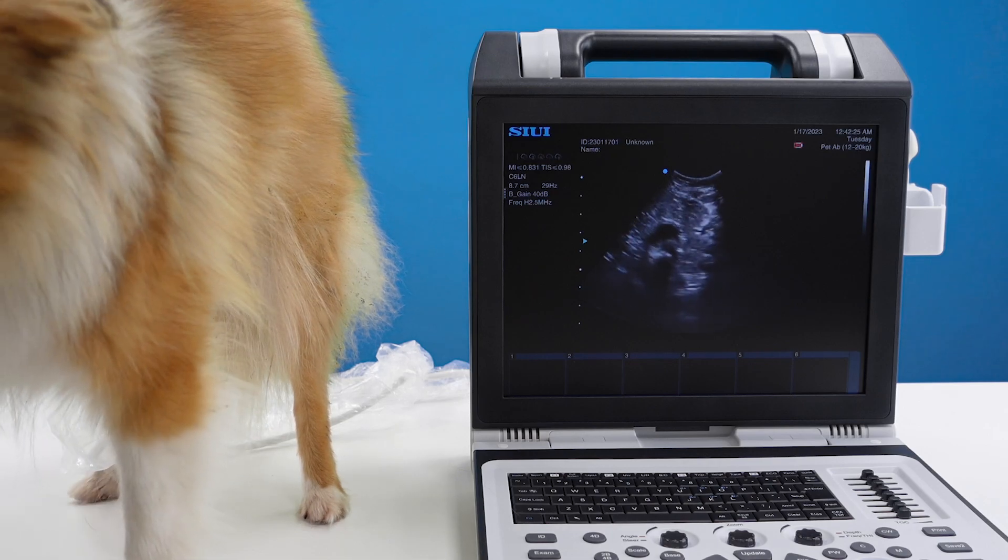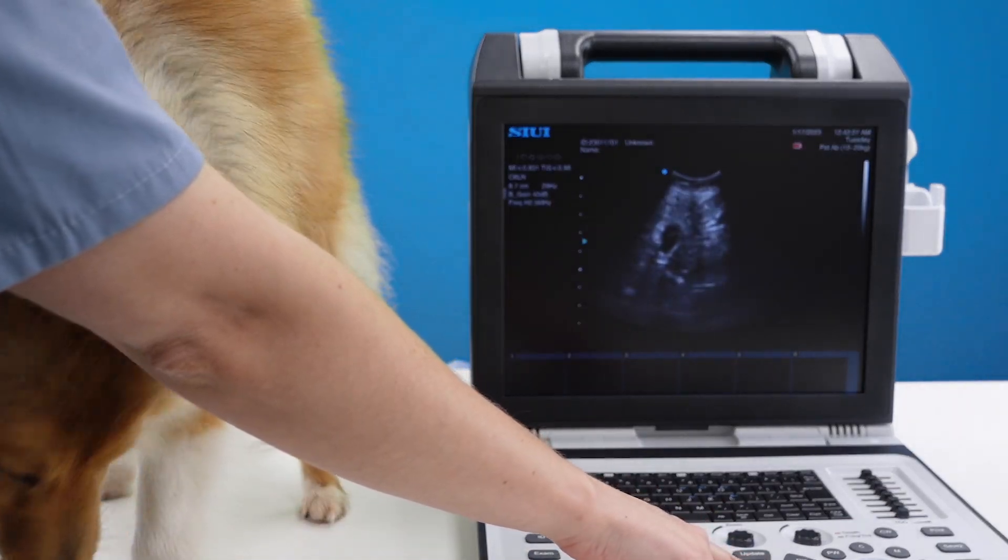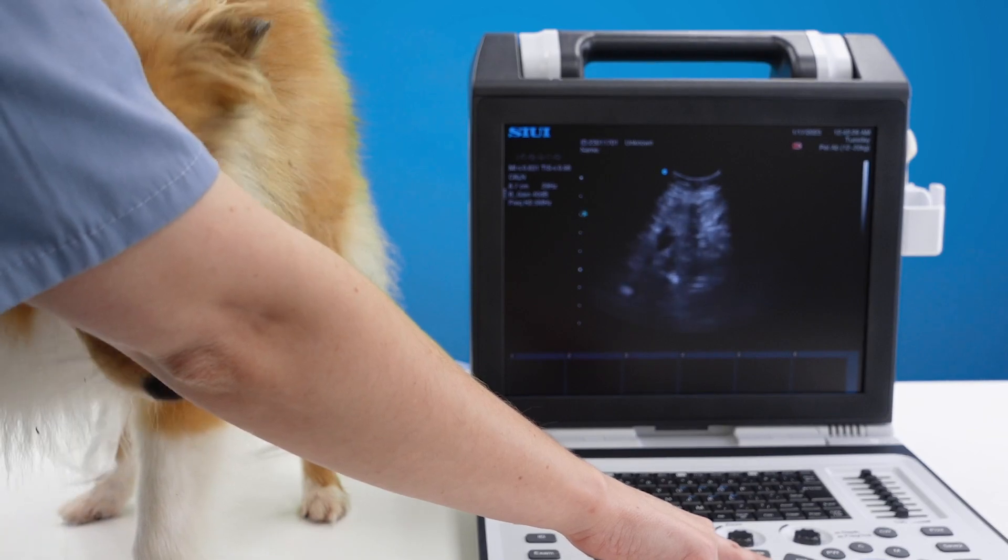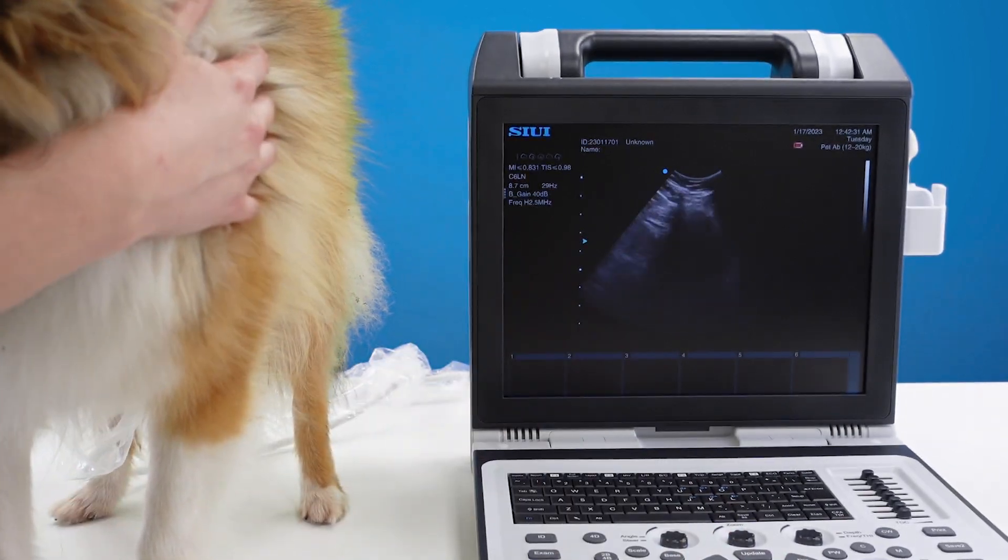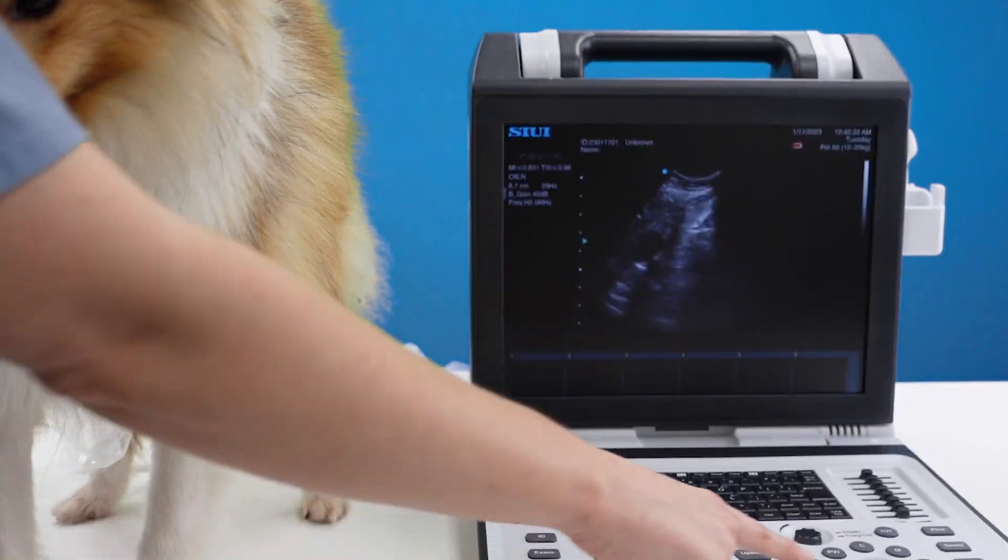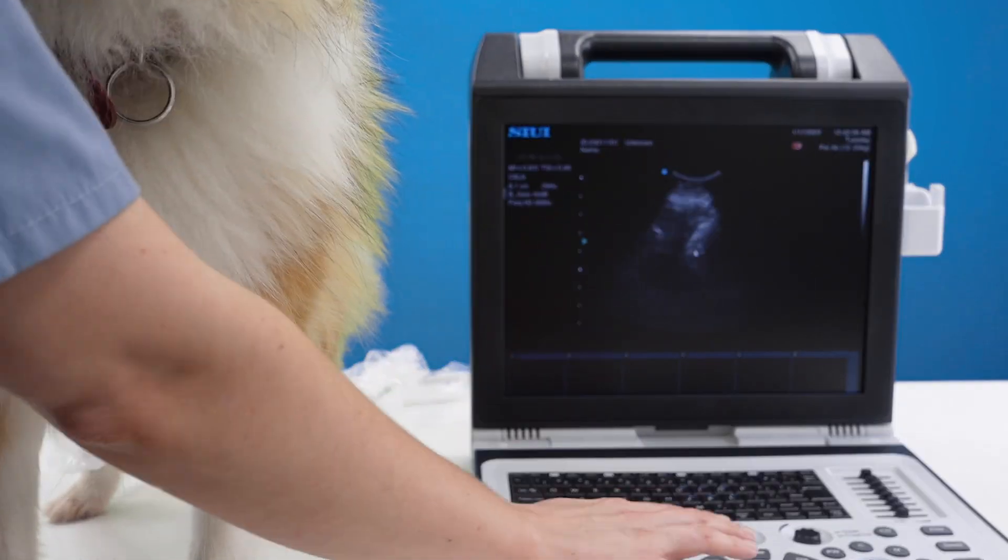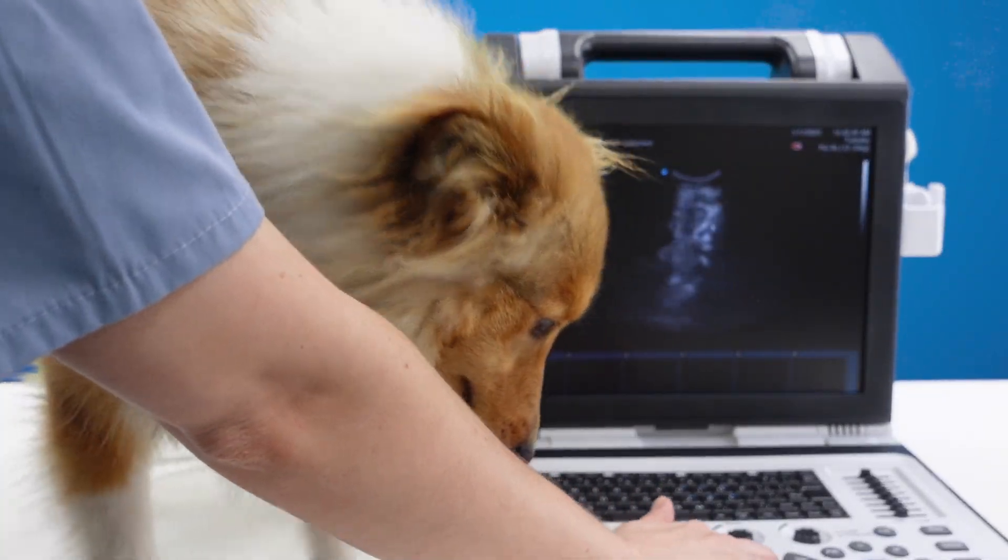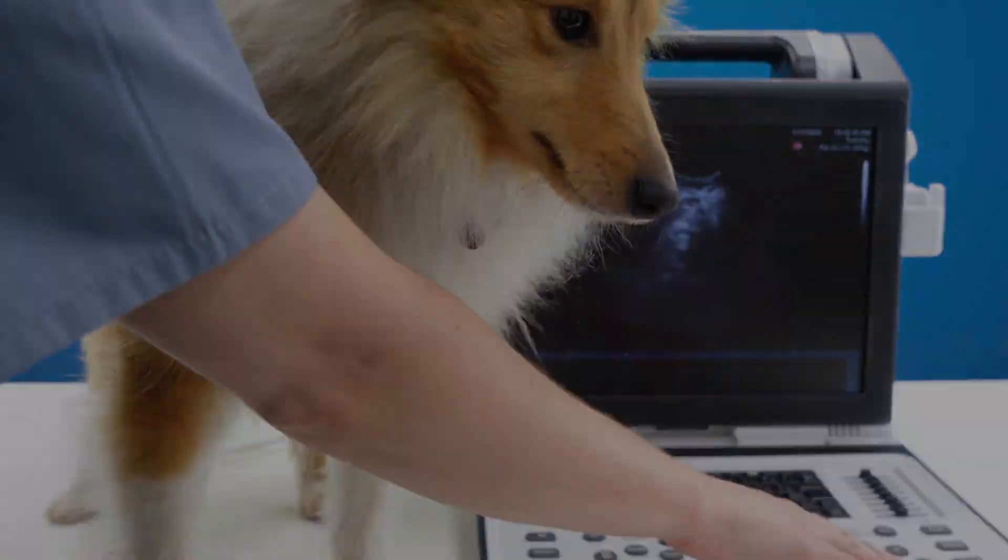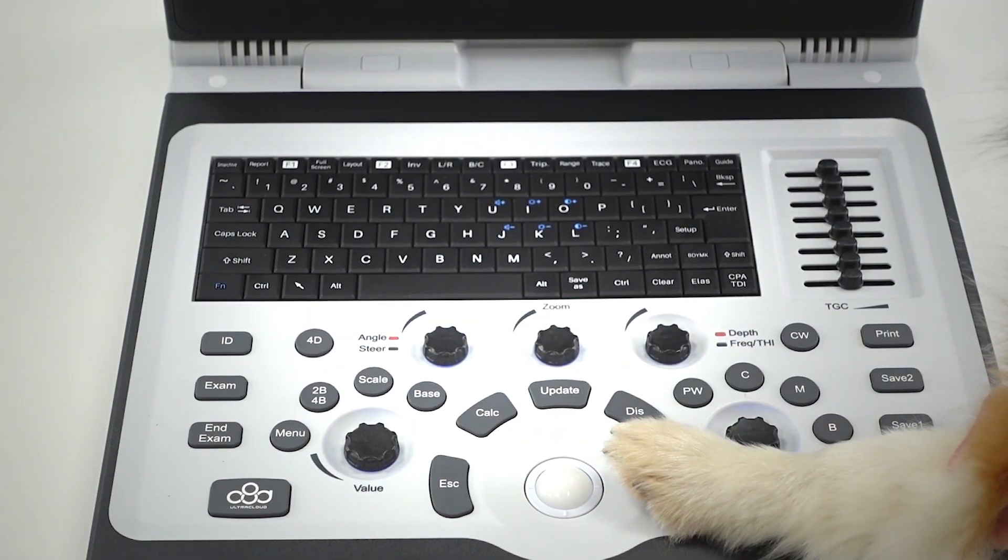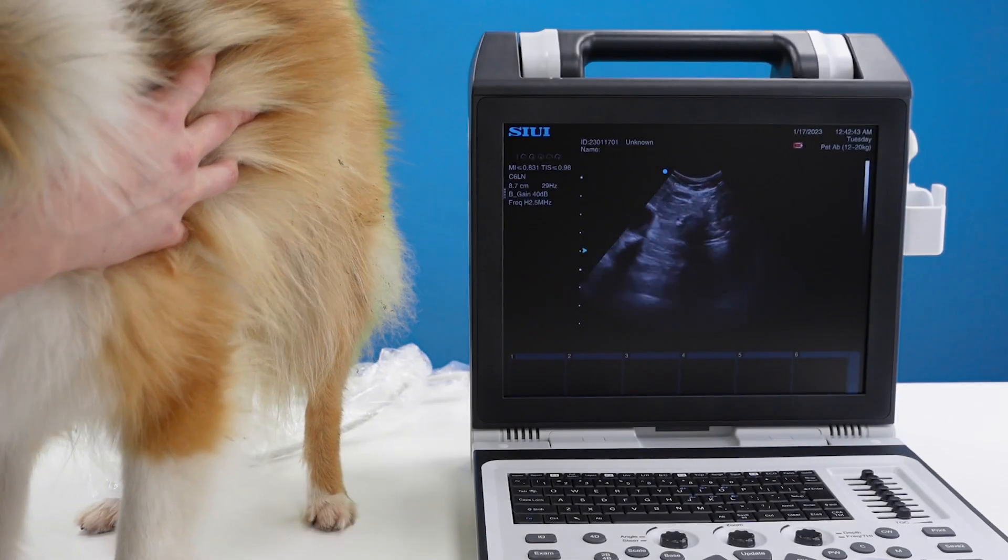If you want to adjust your focal point it's your tracker pad here, just move it up and down. If you want to get hold of your mouse press set. That will deactivate your focal point and give you control of your mouse. You can then press set again to go back to setting your mouse as your focal point.